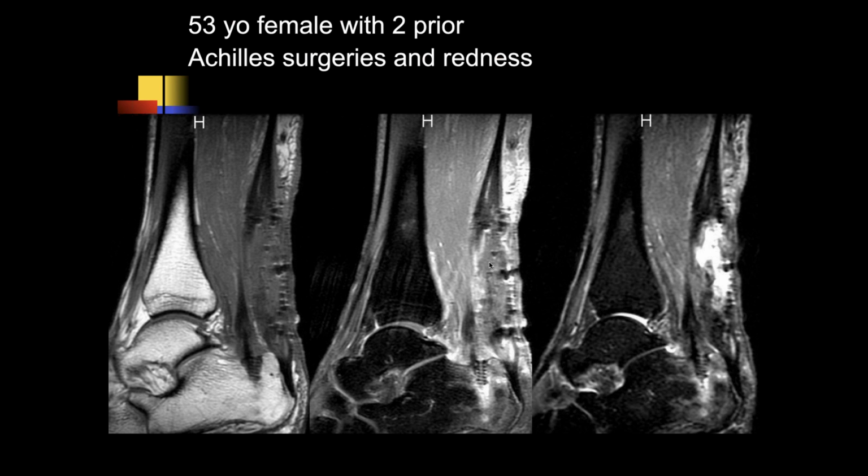Okay, here's Michael. Here's a patient who had a surgery for Achilles tendon rupture, and twice before now came in with increasing pain and redness in the area of the surgery.